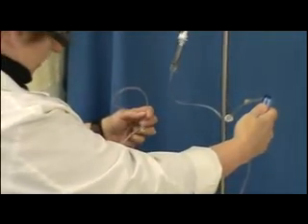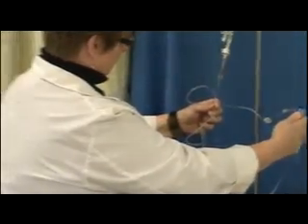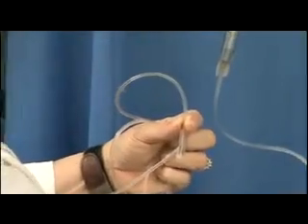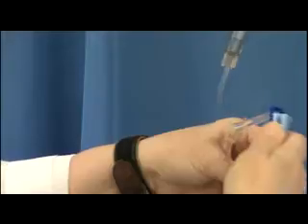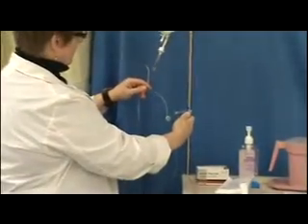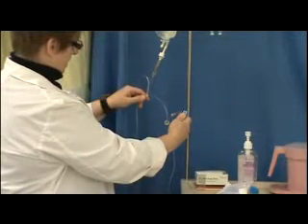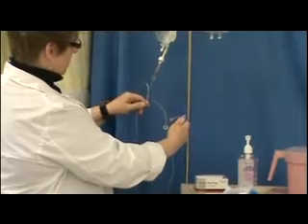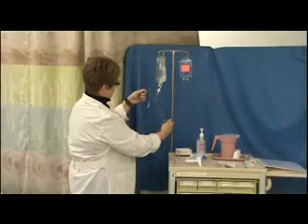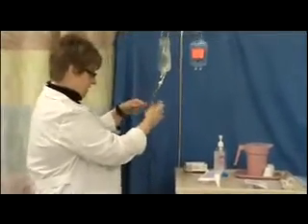We prime our tubing, and here it goes some more, looping its way through. You see the dripping happening here. This port is upside down, and then we've got another port that's going to need to stay upside down while the fluid comes through. Here it comes. And that has pushed all the air all the way out to the end, and then we clamp it. So we haven't even really let any fluid run through, we've just primed it.